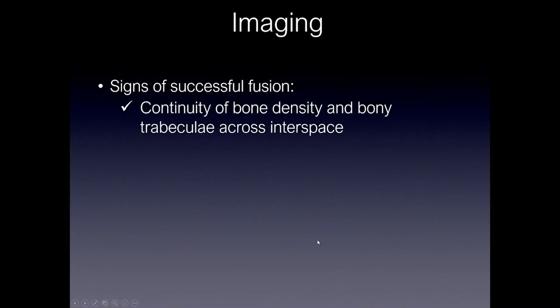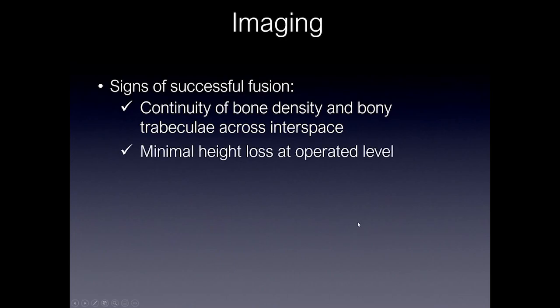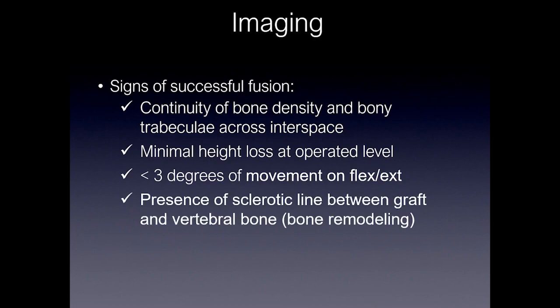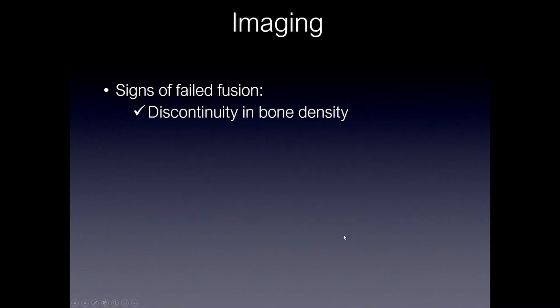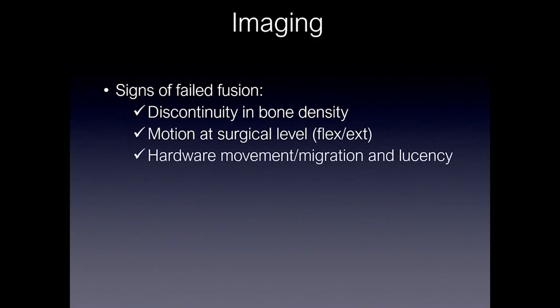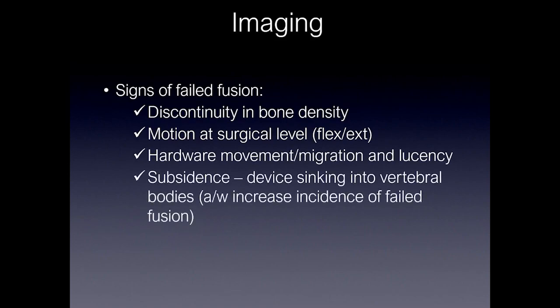Signs of successful fusion include continuity of bone density and bone trabeculae across the interspace, minimal height loss at the operated level, less than three degrees of movement on flexion and extension, and presence of a sclerotic line between the graft and the vertebral bone — otherwise known as bone remodeling. Signs of failed fusion include discontinuity in bone density, motion at the surgical level on flexion and extension, hardware movement or migration and lucency, and subsidence, where the device sinks into the vertebral body and is associated with increased incidence of failed fusion.